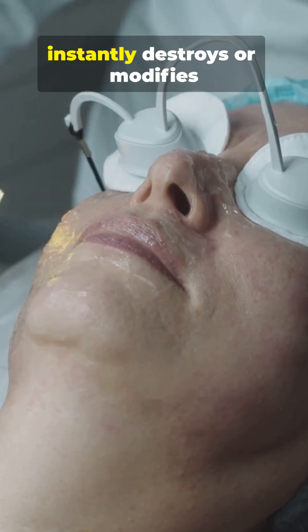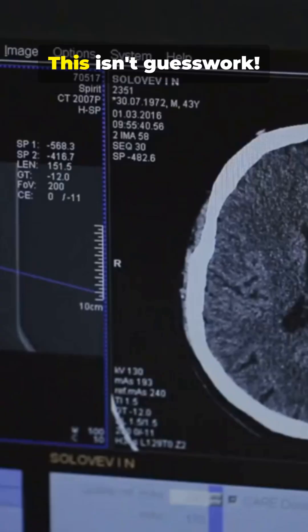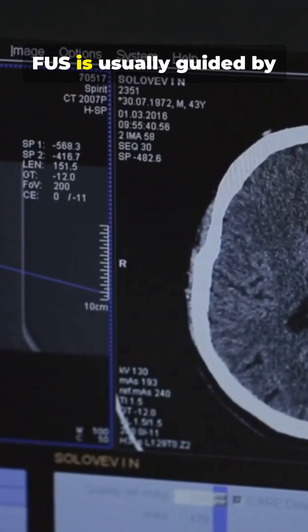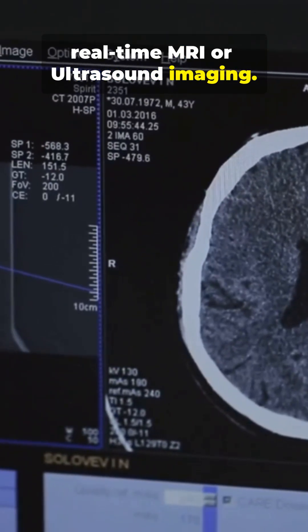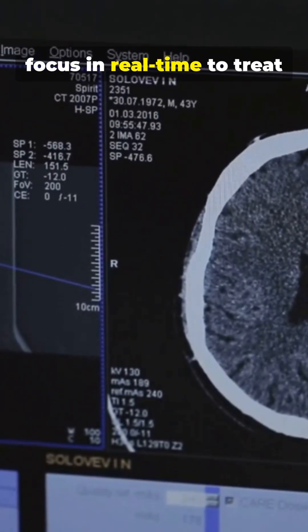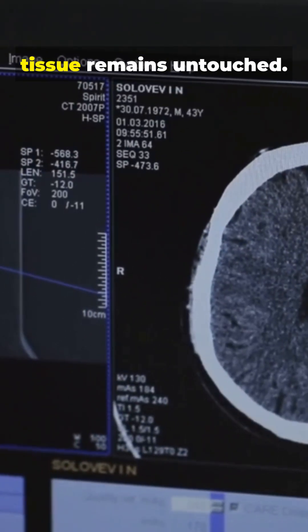This concentrated power instantly destroys or modifies the tissue at the focal point only. This isn't guesswork. FUS is usually guided by real-time MRI or ultrasound imaging. The doctors can adjust the focus in real time to treat millimeter by millimeter, ensuring surrounding healthy tissue remains untouched.